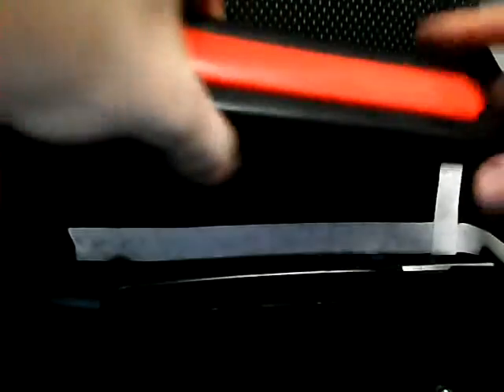I've just gone ahead and applied the adhesive. This is it right here, those little lines of it. Okay, and I've already marked on the wheelchair where I want this to sit, with it ending in the bottom right corner. Now I can already see a mistake that I've made that I'd like you to be able to avoid. The neck part of my wheelchair, right in here, I don't want to end up putting glue into that, so I've just slightly removed the glue with my finger.